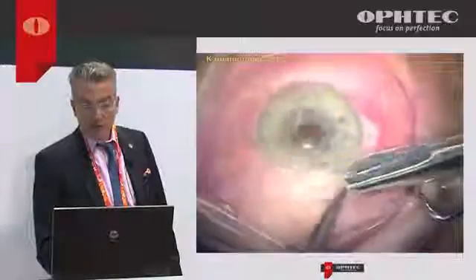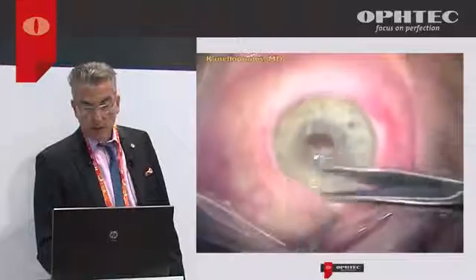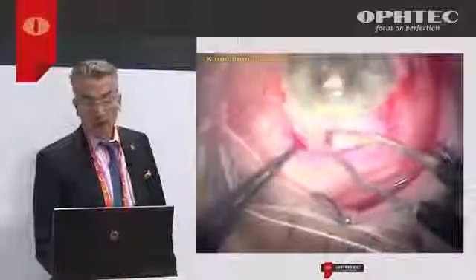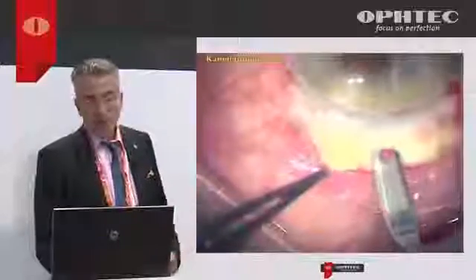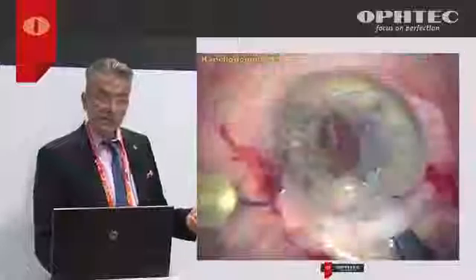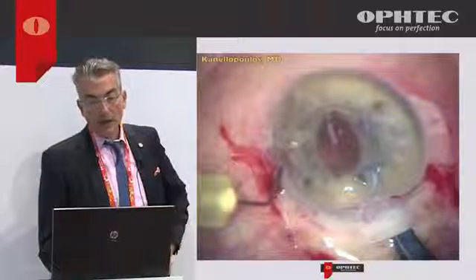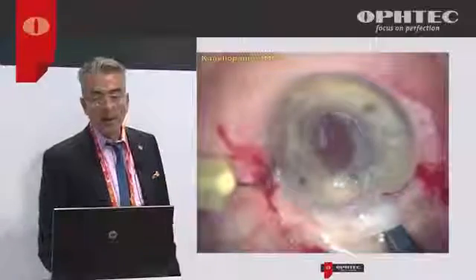And in similar fashion, take the lens out. Far easier than starting to suture that lens behind the iris, which is what I've seen some colleagues do. It's a brilliant technique, but it takes almost triple the time than just placing a lens for which you have more precise biometry. If you suture a lens that was intended to be in the capsule bag on the iris, as you can imagine, you will get a myopic shift of probably 1 or 2 diopters.